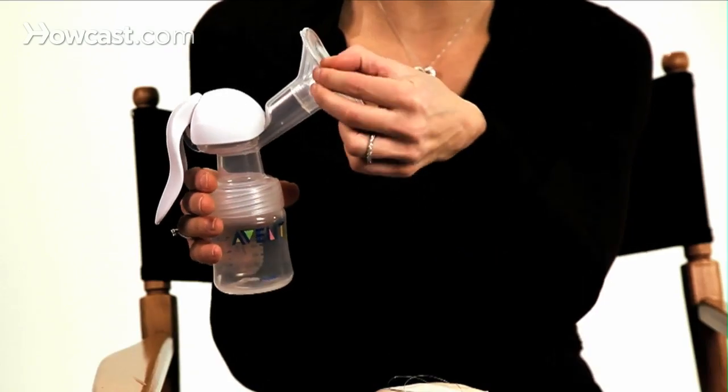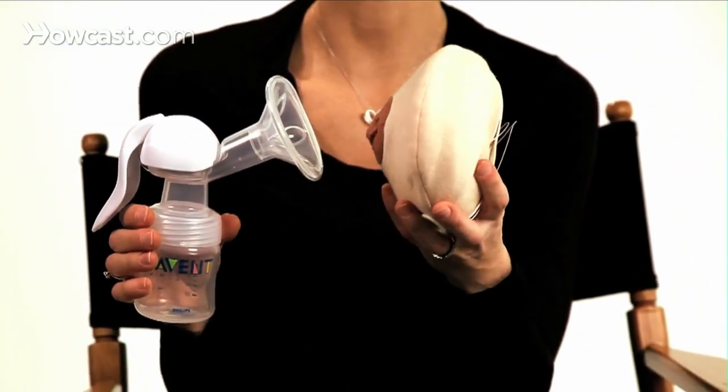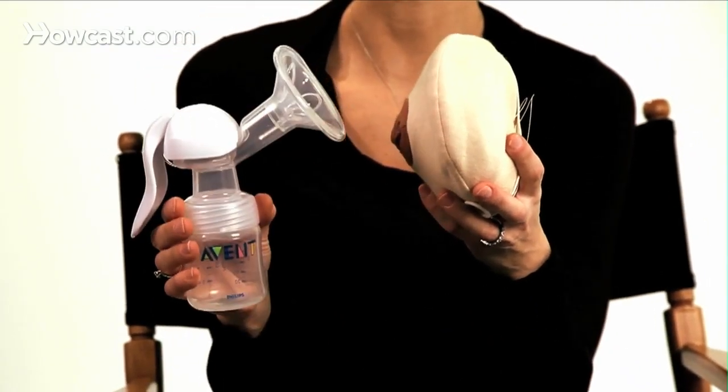If you're using a single pump or a manual pump, then you're going to have to split that up. It's going to take a little bit longer because you're not using a double pump. This is a manual pump, and it really works very well. You can always just throw it into your bag. It's very easy to use, very easy to set up.